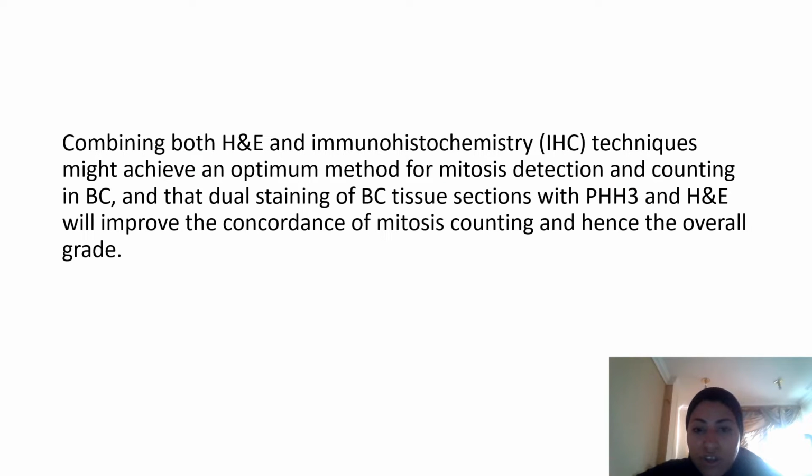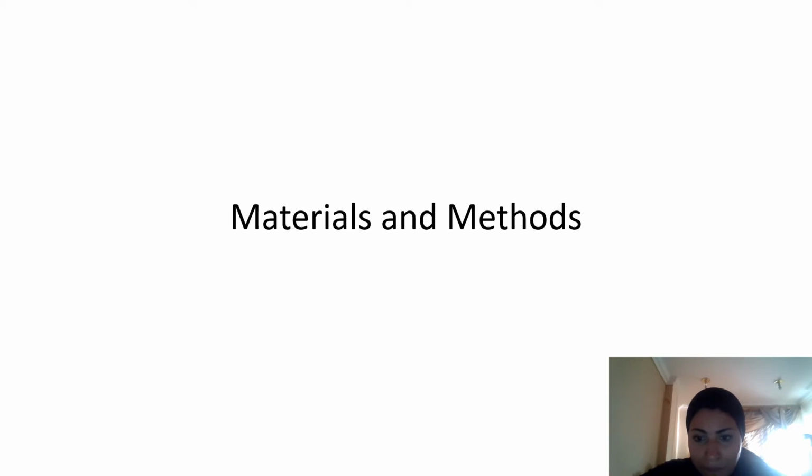Combining both H&E and IHC on one section can achieve an optimal method for mitosis detection and counting in breast cancer. And the dual staining of breast cancer tissue sections with PHH3 and H&E will improve the concordance of mitosis scoring and the overall grading scheme.